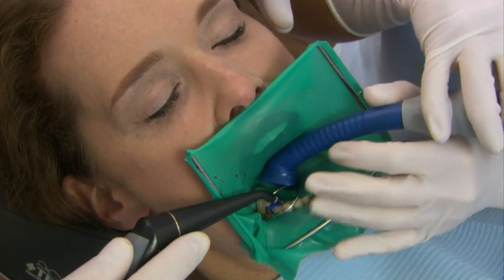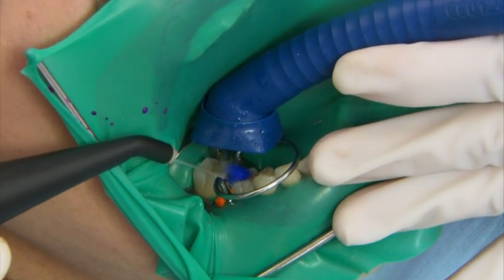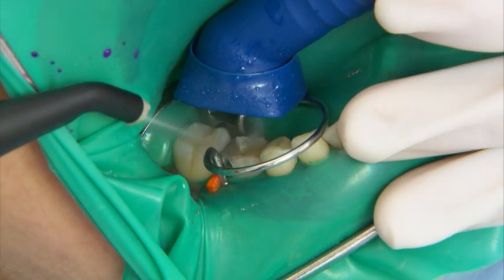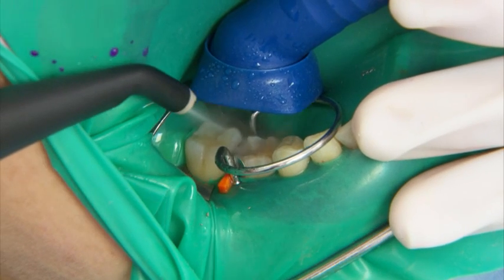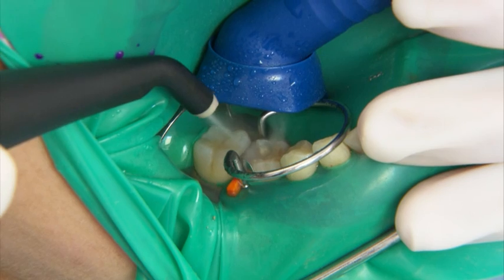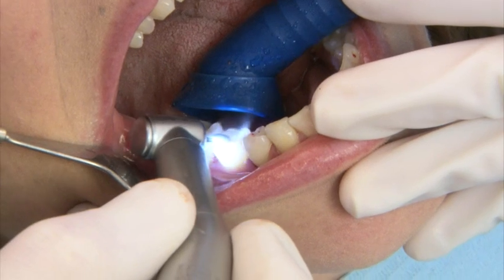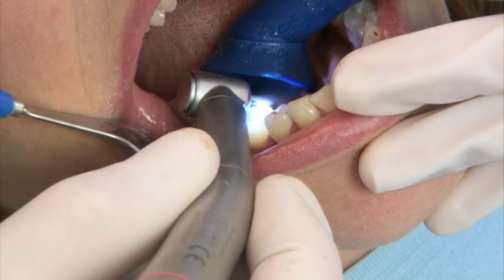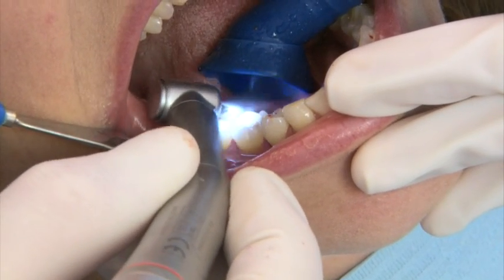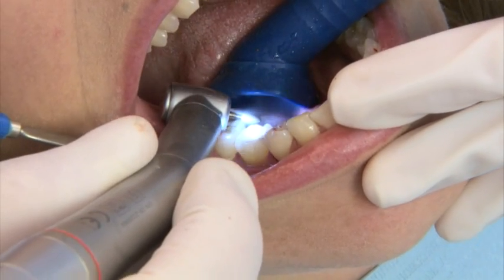A well-positioned Prophylaxis cannula completely removes the rinsed etching gel and aerosol, ensuring the etching gel does not reach the healthy, hard-toothed tissue. During polishing, excess filler material and aerosol are aspirated by the Prophylaxis cannula and prevented from spraying out from the polishing head.